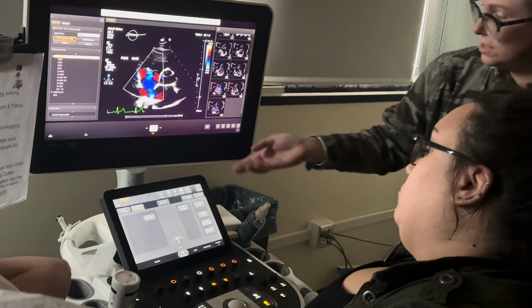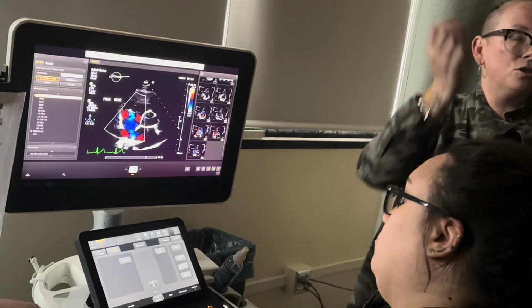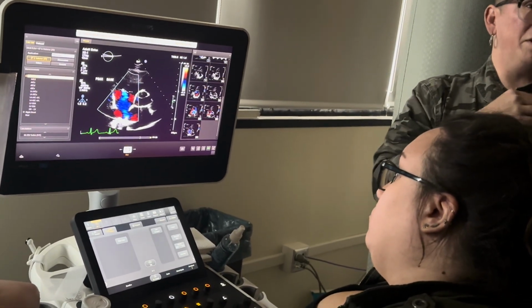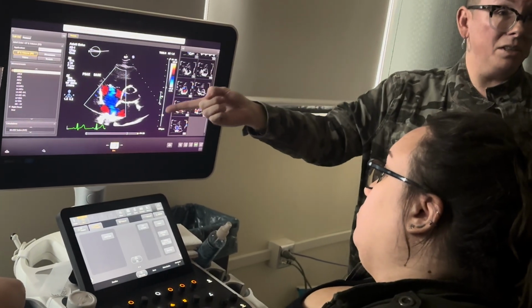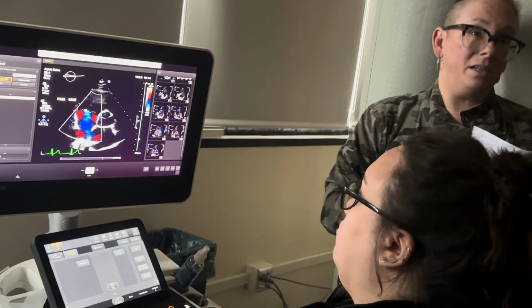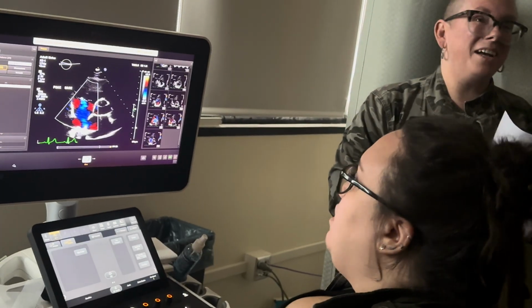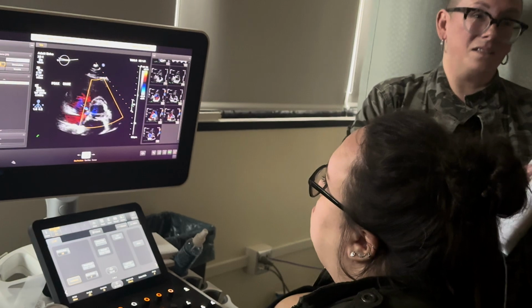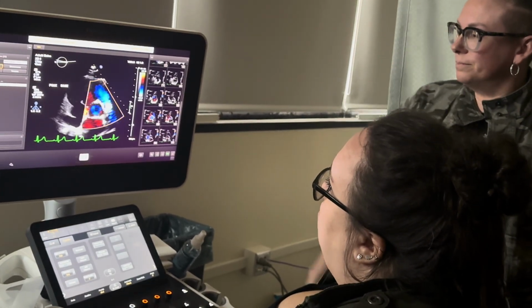She's at 67 beats per minute, and that's what we're watching. So that's why it's hard. You have to slow it down to understand. But this is what we do all day. We're so used to seeing it that we know that's it, and we know how to get our pulse waves. But you guys don't know how to do that yet. You're just learning how to turn the color on. It comes with more exposure. You're not learning disease yet, okay? Disease stuff comes next semester. It definitely happens more with exposure.